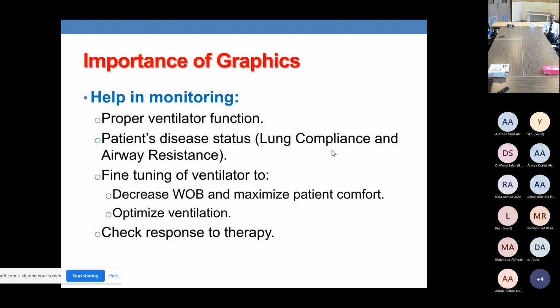So the old balloon is the normal lung, and the new balloon is the stiff lung of a fresh preterm baby with RDS, which has very bad lung compliance. The best example of compliance problems is respiratory distress syndrome in neonates, especially in preterm babies, due to surfactant deficiency.